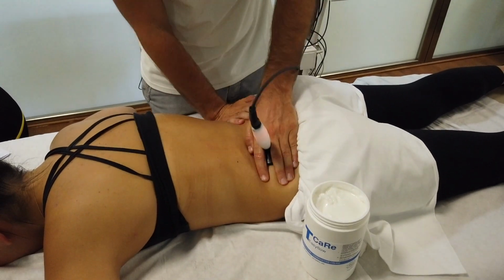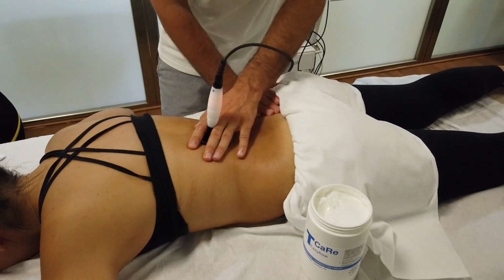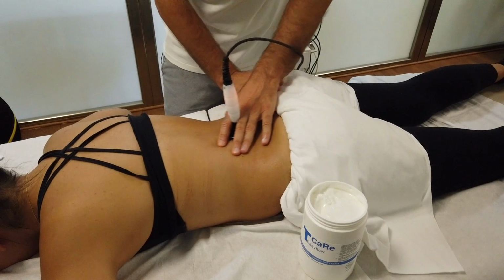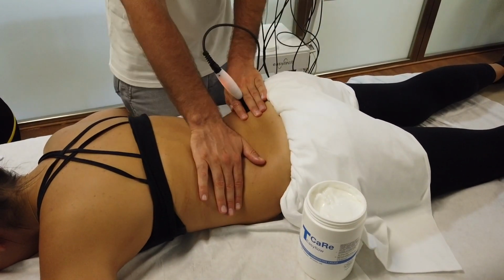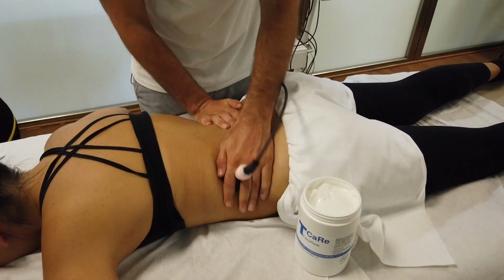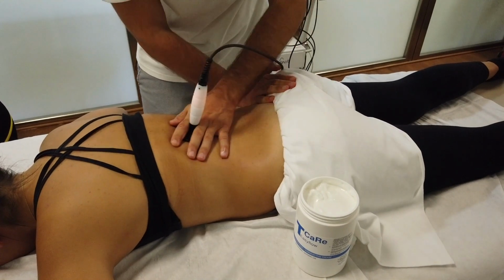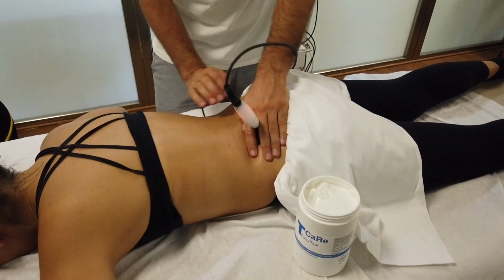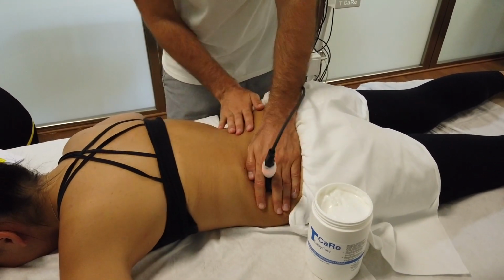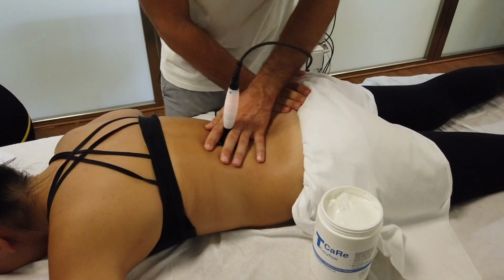And I have to move the electrode continually to avoid burning the tissues. And in this modality, when I combine the manual therapy with the diathermy effect, it is a very pleasant treatment for the patient, who has an instant decrease of pain.